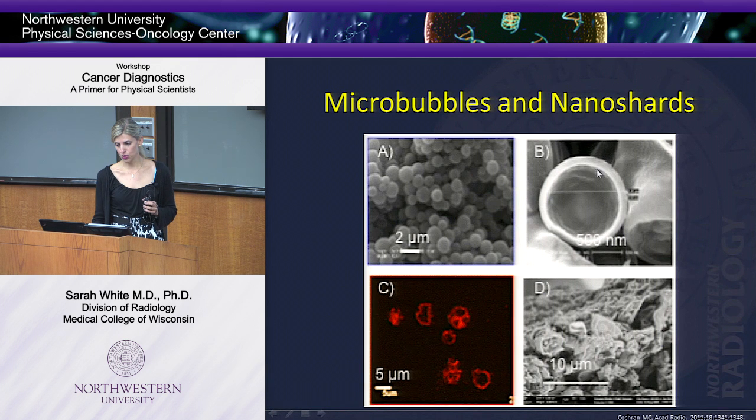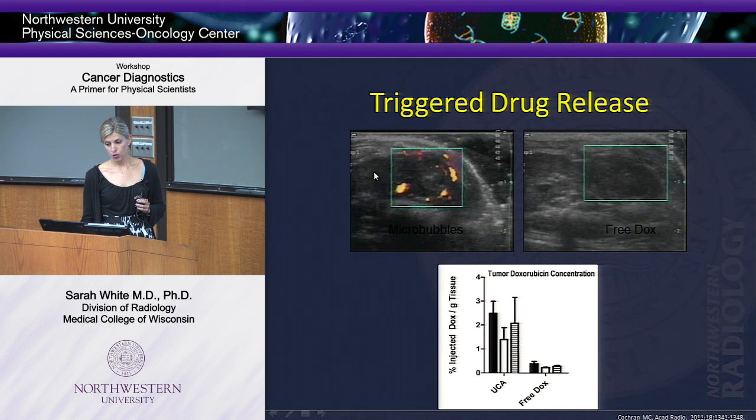And this is just basically what they look like. Okay, this is the gas core. This is doxorubicin. This is just a drug that we put on them. This is what they look like after they've exploded. And this is what they look like when we've infused them.